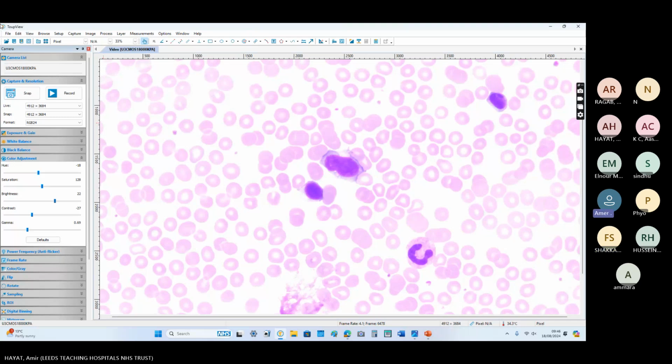So then, comments on the blood cells, your probable diagnosis and suggestion of further tests. This will complete your report for 6 marks in the FRC path exam. All right. Okay.